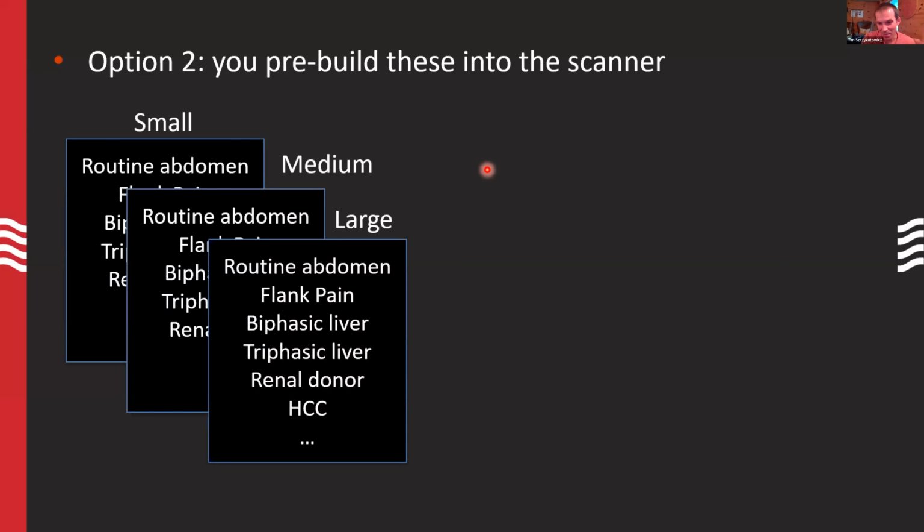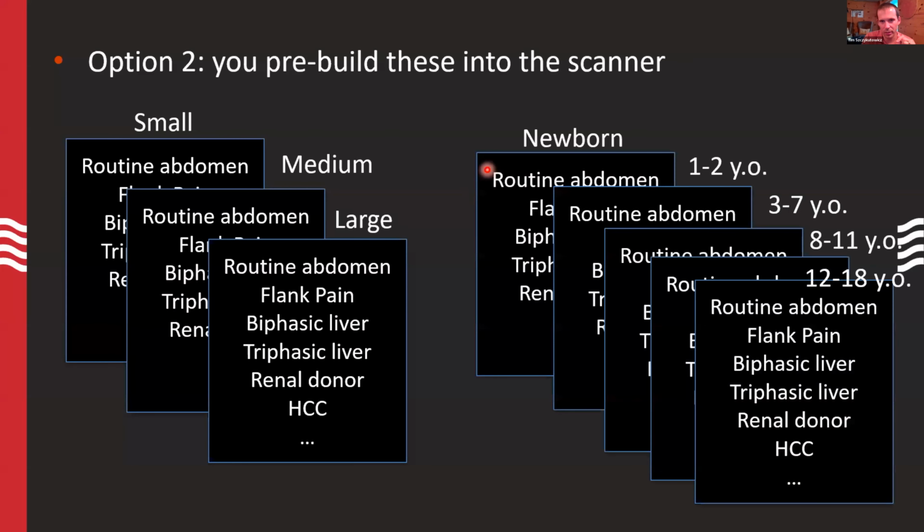They're just either eyeballing the patient, which in reality is how a lot of technologists would do this, or maybe after they take the localizer, that's the scout, topogram, SurView, whatever you want to call it, they can take a few measurements and then change the protocol to reflect that patient size.